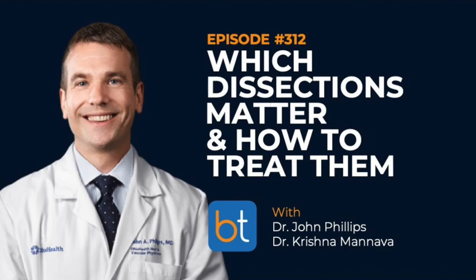And then you can think about maybe, this is an interesting dilemma here. I'm not getting good blood flow. What should I do? Does it play a role there? Maybe. The other thing I like about it is that I always tell people it allows you to be a little bit of an artist. A stent is pretty brain numbingly easy. I mean, my kids could deploy them. The tacks are a little bit trickier, so you've got to get good at it. Once you get good at it, you can nuance it and figure out, all right, maybe I'll put it this way, or maybe I'll put it here.